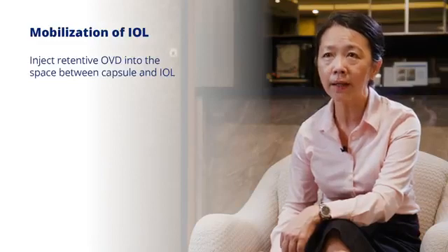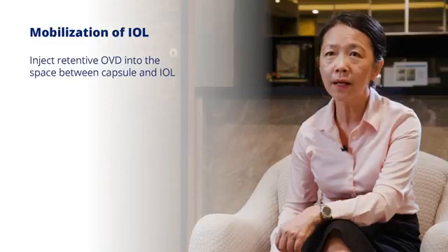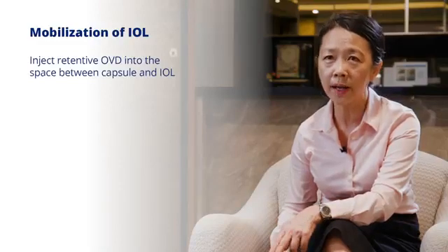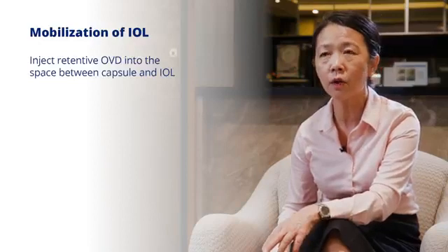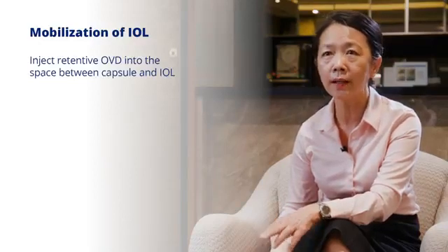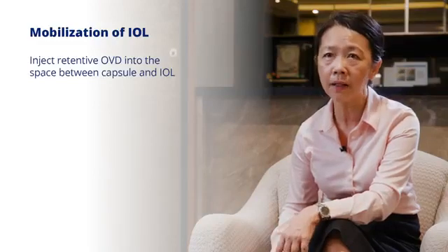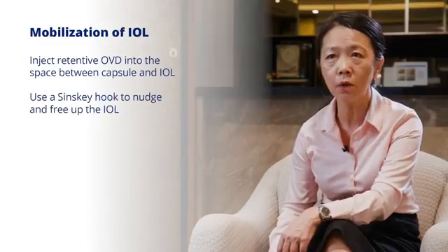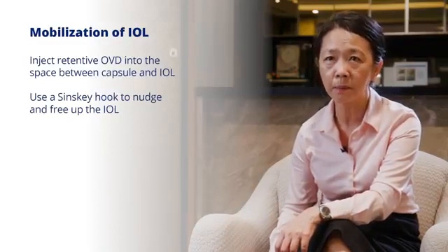Now, once you get into the space between the capsule and the intraocular lens, you then sneak in your cannula under the capsule and then slowly inject the retentive viscoelastic into that space and advance your cannula tip so that you can get the viscoelastic going around 360 degrees and behind the IOL optic. Now, the next thing to do is to use a Sinskey hook to nudge this IOL optic and then to free up the lens completely.